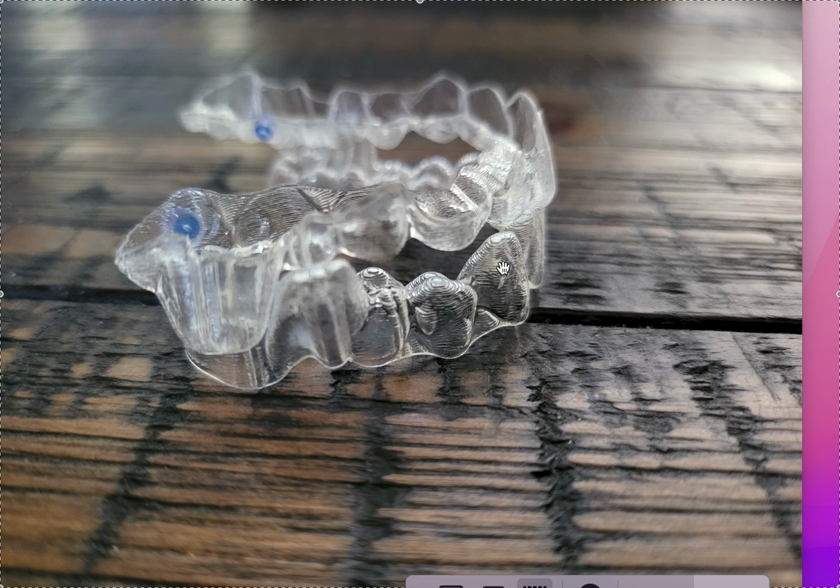The only thing that can happen that I've seen that you just have to know about is a lot of times you will get a posterior open bite in this area. It's just because of these wings. But I've never seen an MA case where you didn't have to do a major refinement. I know they make it look like it's going to make everything perfect, but I think the algorithm's just not there yet. So I think you go into it.